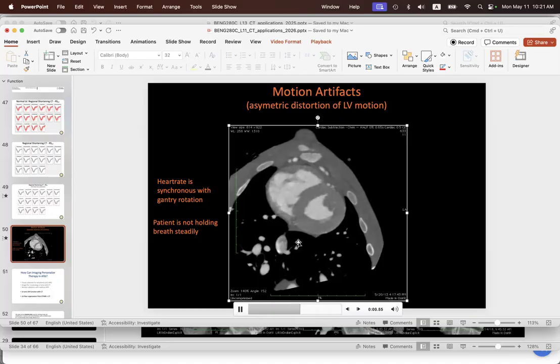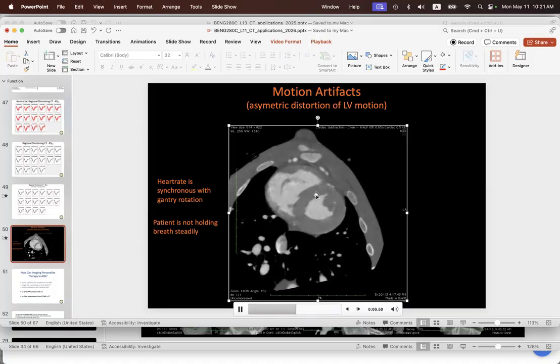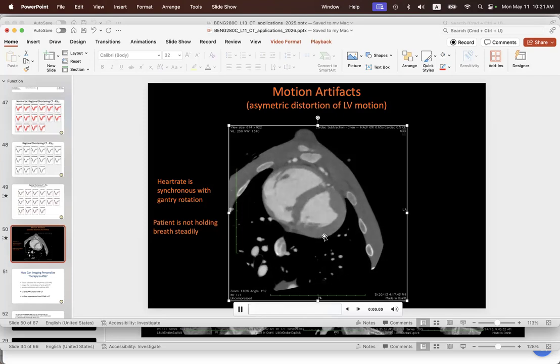around it? And so this motion artifact is something you really want to get rid of as well when you do cardiac function. If I want to measure when this wall contracts inward versus this wall contracting inward, I really do have to do motion correction in order to get the timing right.